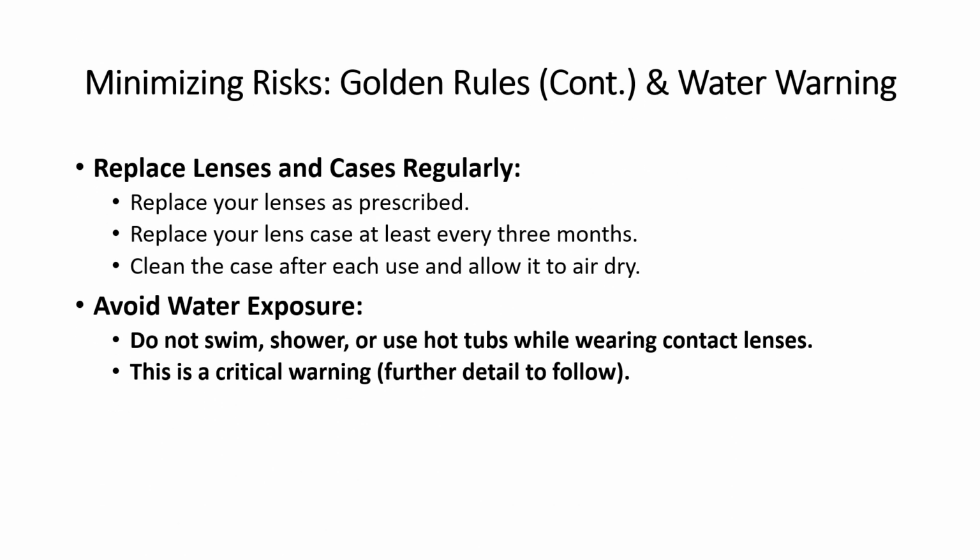Continuing with our golden rules for minimizing risks. Fifth, replace your lenses and lens cases regularly. Replace your lenses exactly as prescribed, and your lens case at least every 3 months. Make sure to clean the case after each use and allow it to air dry. This prevents the buildup of harmful biofilms.